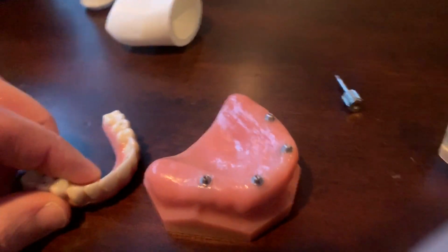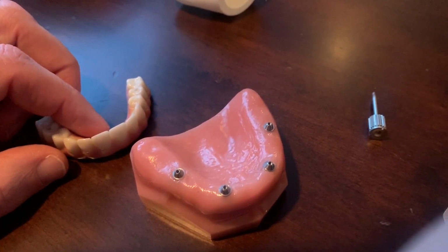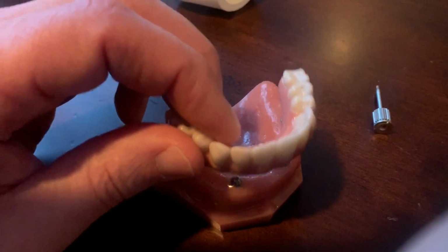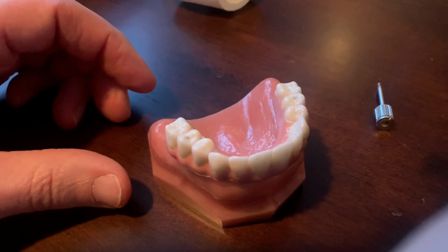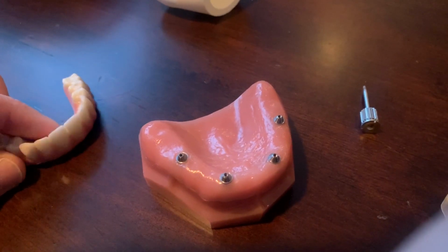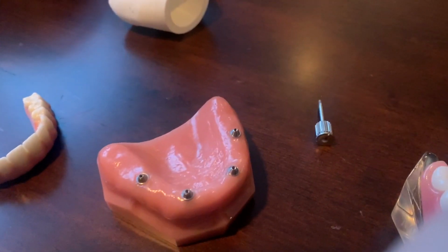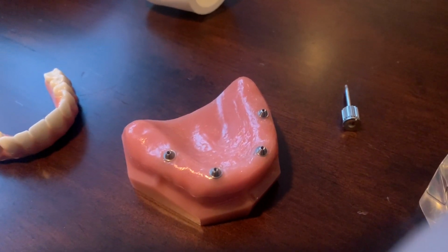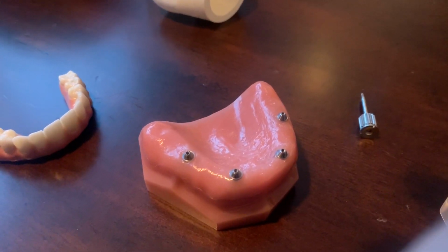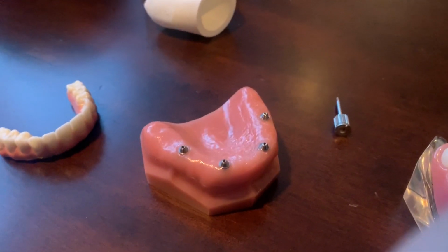The other thing is, this is your classic all-on-4 case, and it's called all-on-4 because you're putting in literally all the teeth, and it's getting permanently placed down on top of 4 implants. I really don't recommend at all doing just 4 implants. It'd be much better to put 1 or 2 more in there, because God forbid you lose an implant, or 4 is like the bare minimum. So you're going to put all the forces of 12 missing teeth on 4 implants.